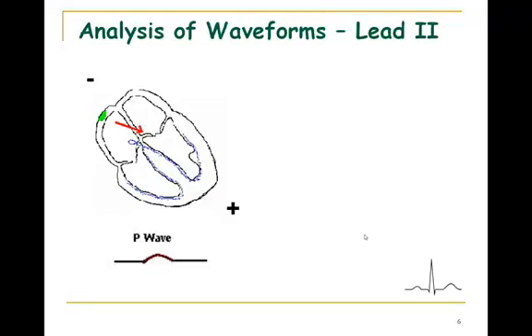But if you connected your electrodes correctly, and I see an inverted P wave, I may see that in conditions where you have an electrical impulse that was generated down here towards the AV node. So if something fired here, the impulse will be moved down through here to the ventricles, but also up in this direction to depolarize the atria. And so that vector is going to be running towards the negative recording electrode, and you'd pick up an inverted P wave.